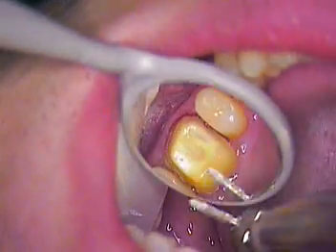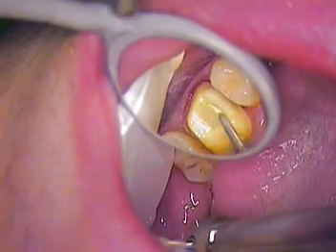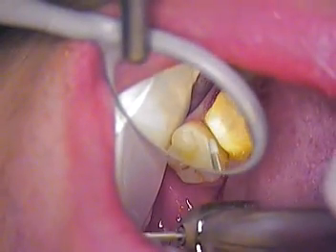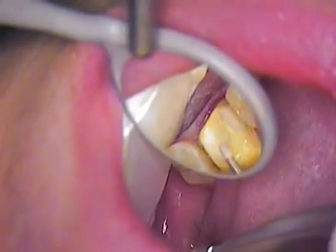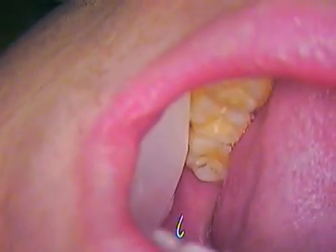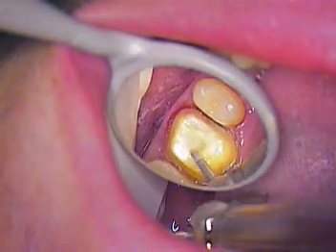Open please. It's just the straight lingual cusp right in here. I'm going to develop the groove. Let's see if that was enough, because I have to go back in and polish it. Close again all the way down — stay closed. That slides out even better. Close again all the way down — comes out with a lot less retention. Good. Just a little more polish and then we're good to go.